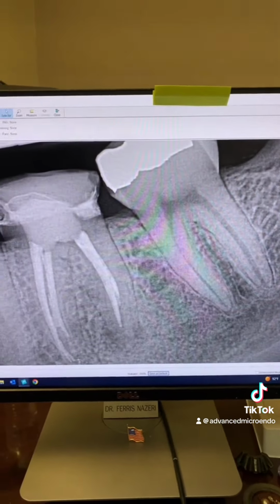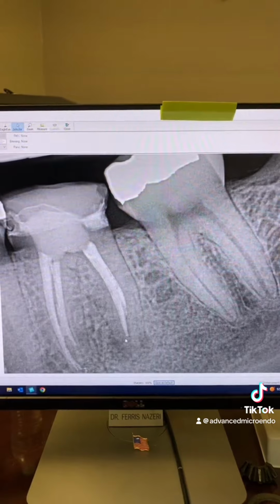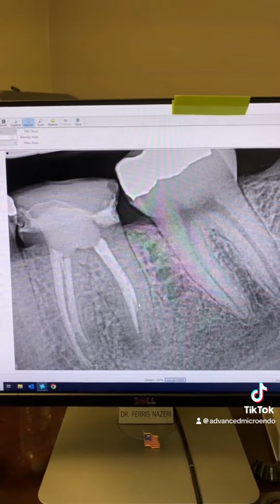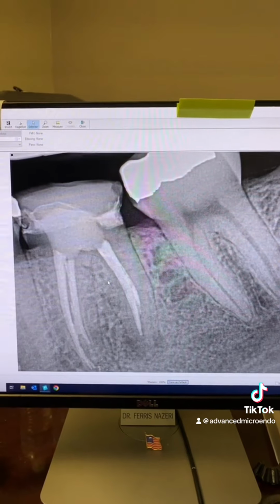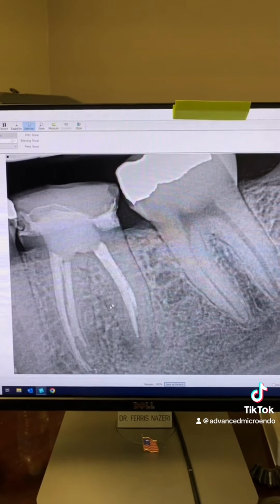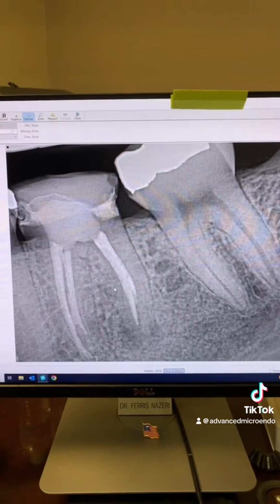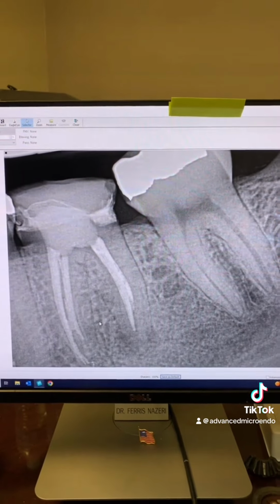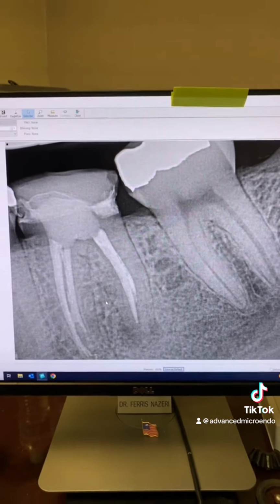All right. When you look at this radiograph, then you can see why there's a problem here. Of course, the dentist left necrotic tissue and bacteria behind, but also missed the canal. This tooth has another canal. So I don't need to take a CBCT because with just 3 PAs, I figured out what's wrong with this tooth and what my course of action is. So no need for a CBCT, in my opinion, because 1, 2, 3 PAs, and I already know what the problems are.